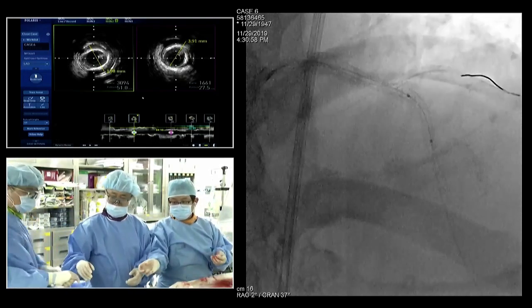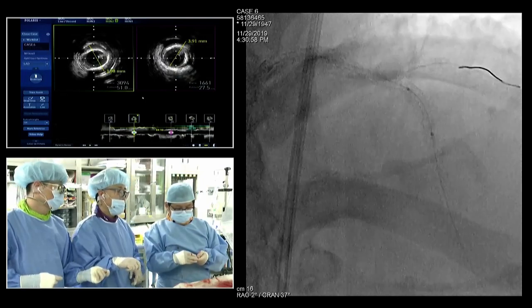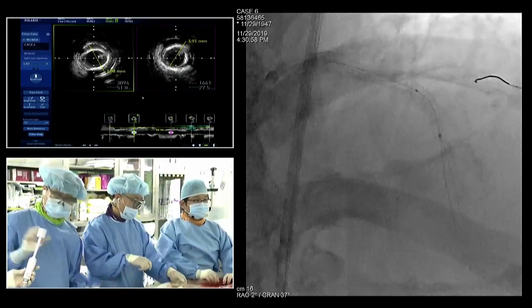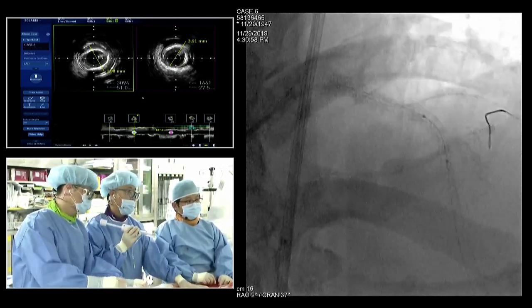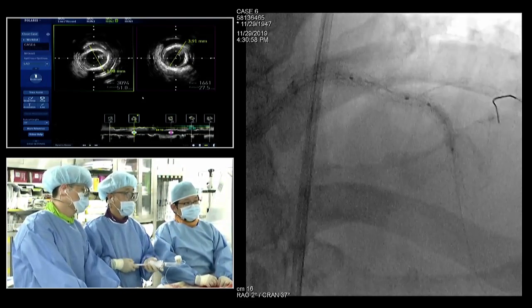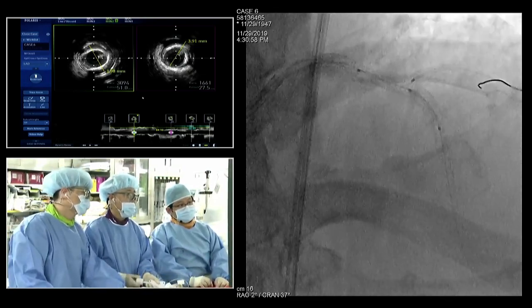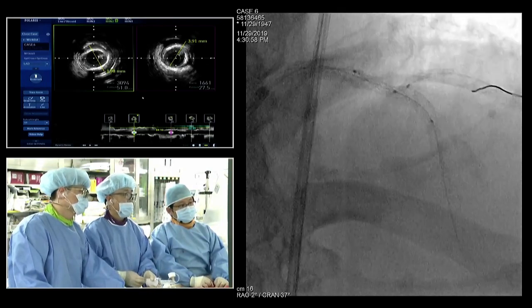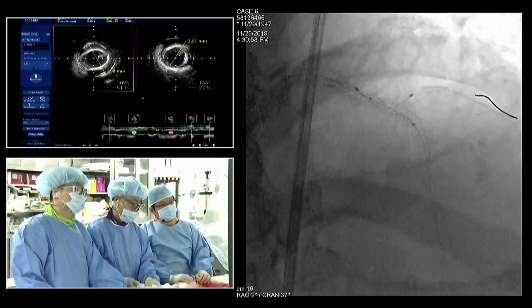This is a 2.25 stent balloon, and we already did high pressure balloon dilation from the distal LAD to the proximal LAD using 3.5. This is just the last step, LAD 6, 8. Okay, good. Deflation. Diagonal inflate. 6, 8. Okay, deflation. Still some indentation. Okay, good. One more. Dr. Park, six.